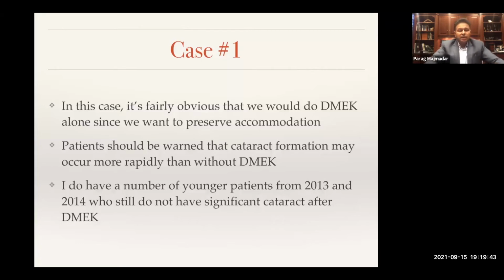You've got to take out the cataract. They're going to get significant cataract. Now, I will tell you that the Price study did show that a significant number of patients did get cataract within the first year. But I think our technologies have evolved, our techniques have evolved, and our management of the air bubble or the gas bubble has evolved.